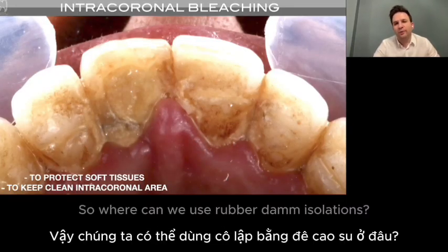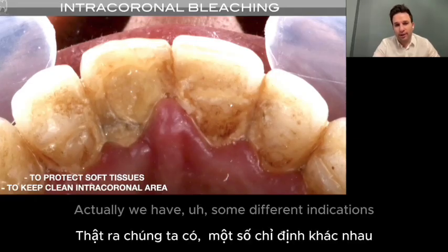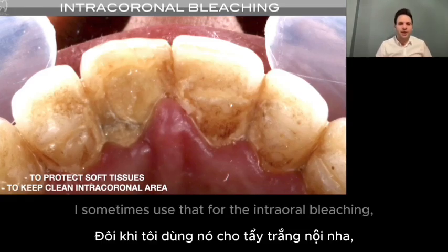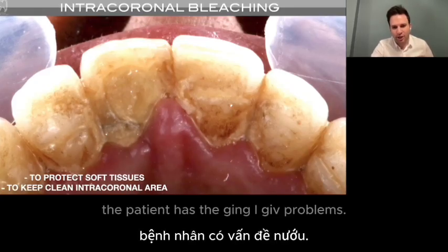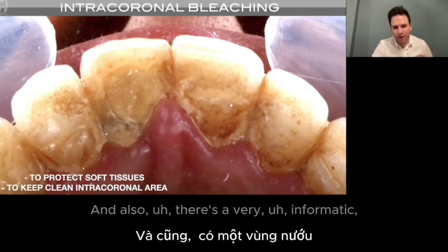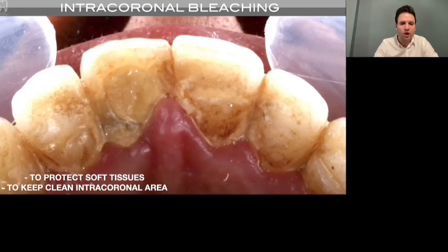So, where can we use rubber dam isolation? We have some different indications for the rubber dam. I sometimes use it for intracoronal bleaching. For example, in that patient, the patient has gingival problems, and there's a very inflamed gingiva nearby the tooth.